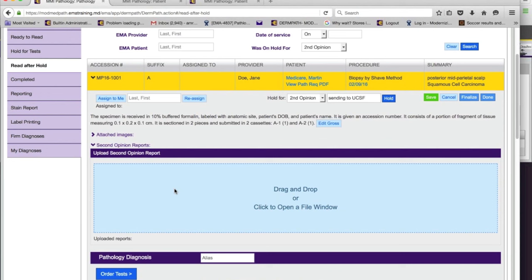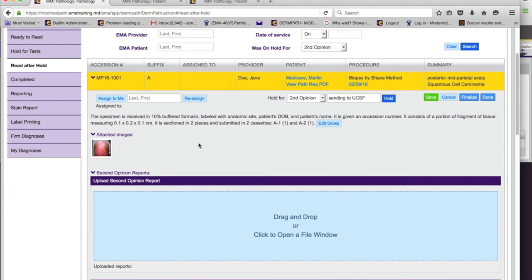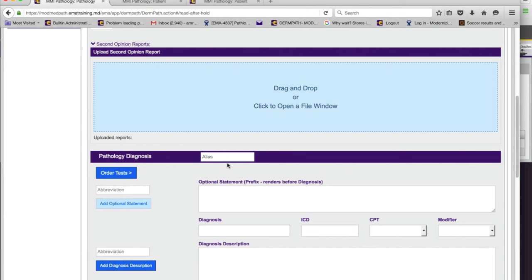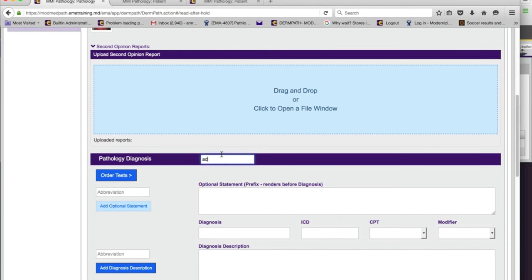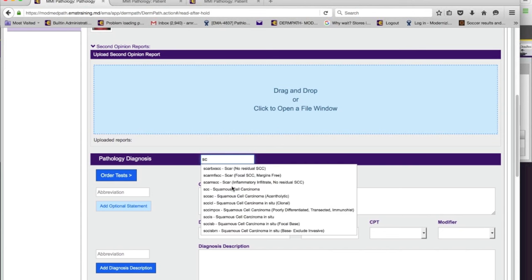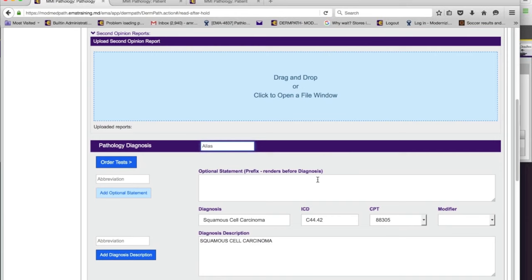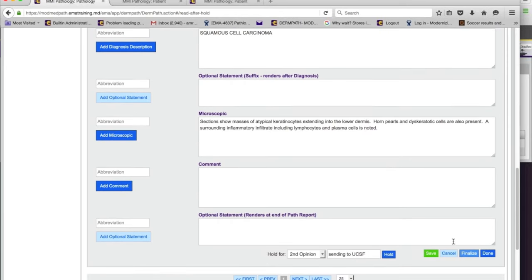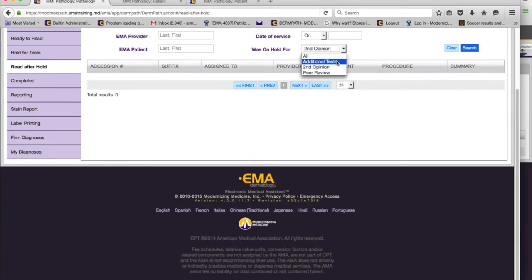Once you upload the second opinion report, it goes back to the clinical side. They will receive your pathology report as well as the second opinion report. Images are always available for you to see. Whether you've entered a preliminary diagnosis before or haven't, you can finish the case here and say done.